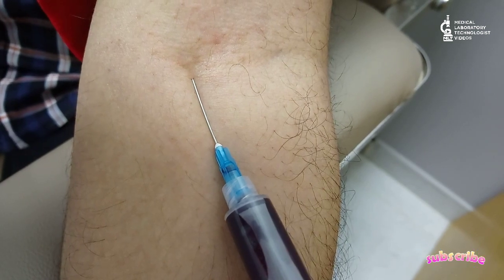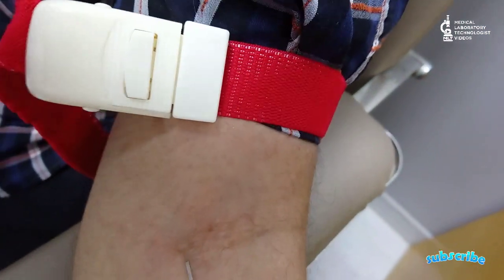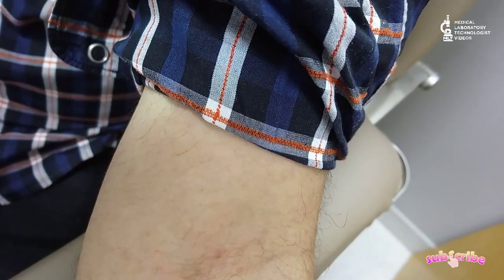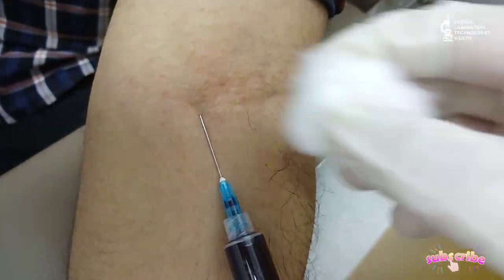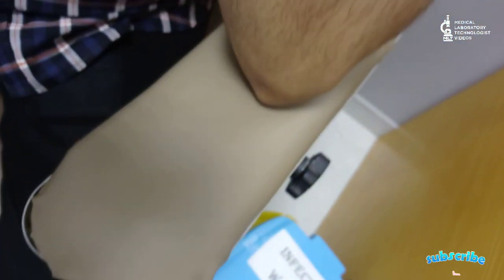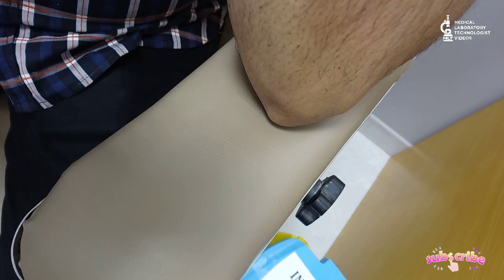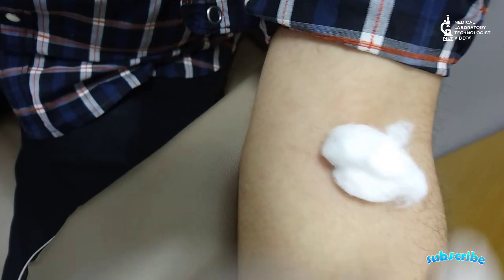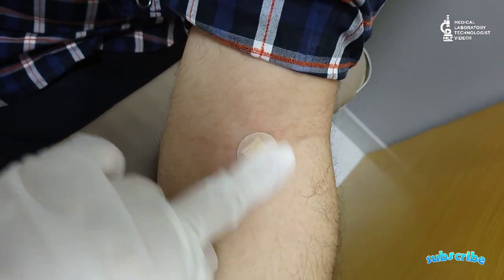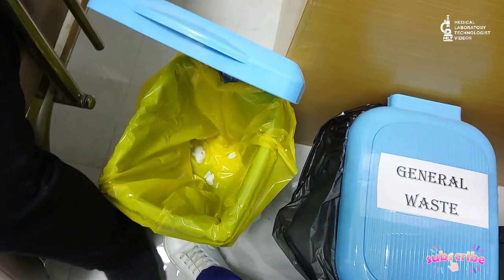Once you have taken the sample, hold the cotton — but don't press. This is the second key point: hold the cotton, don't press. Once you take out the needle, then press the cotton. Before removing the needle, open the tourniquet. Then just hold the cotton. Once I take out the syringe, then I press. If you press first while also withdrawing the syringe, this will cause more pain to the patient.